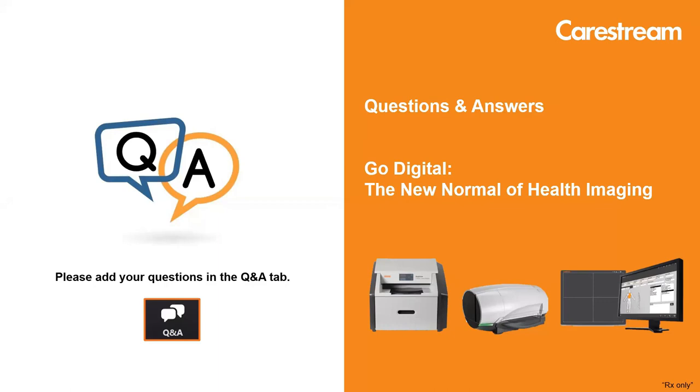In spite of this, detectors of course may suffer if they are dropped, or if they are not handled properly. They may be sensitive to accidental damages. If the detectors are used in a normal way, there is no issue because there is nothing that wears inside.